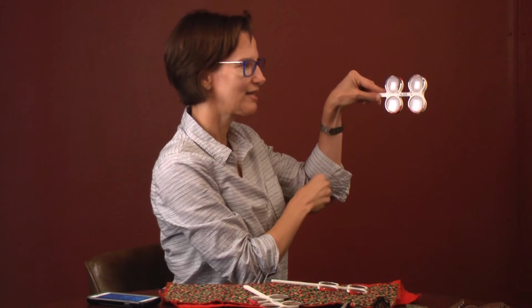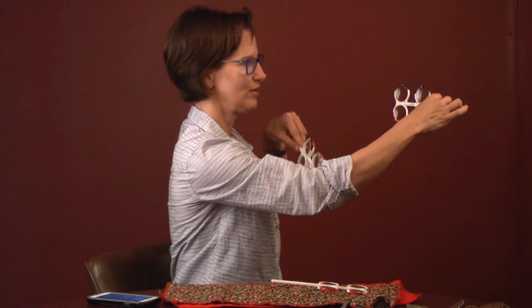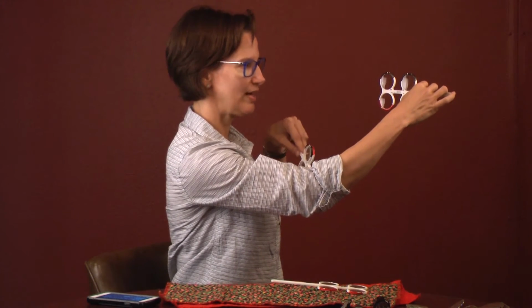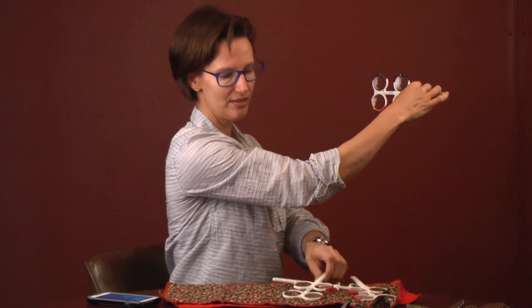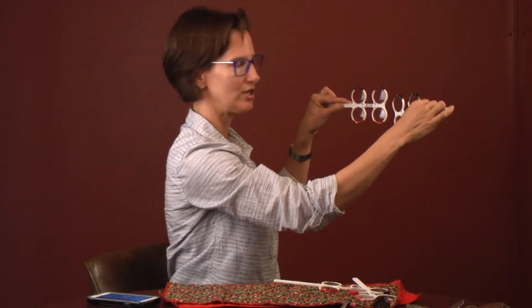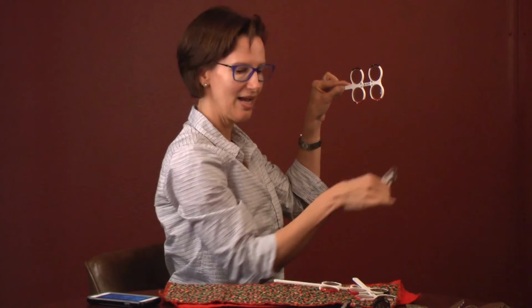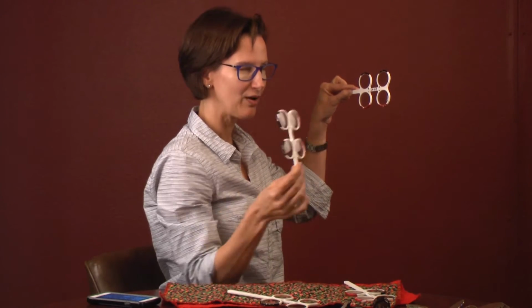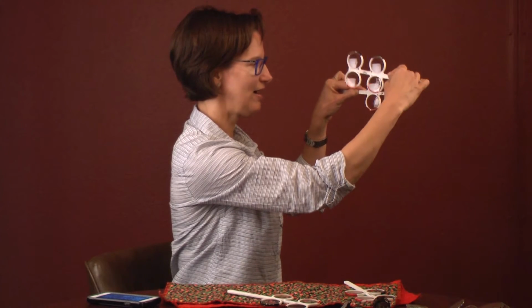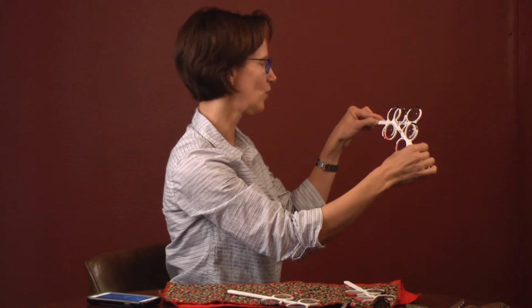So let's say they like the negative 1.25, well then we'll go up. Try the negative 2. If they like the 2 better, then we'll set down the paddles. I'll grab the red negative 3 and compare those two. I'm just working up until we've reached a point where they don't need to go any further. And then when I have the final point, I'll fine tune it with that 0.5. I'll add a little bit of plus 0.5, add a little negative 0.5, and they can decide which one works best for them.